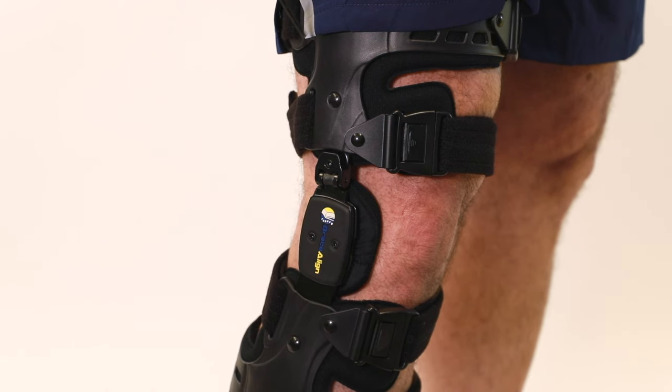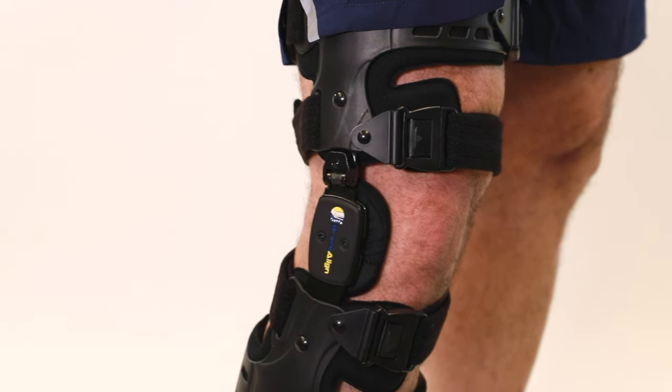Once in proper position, if it relieves pain with the initial settings, no further adjustments are needed.